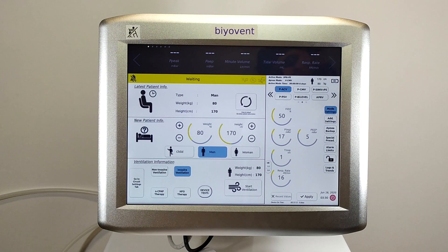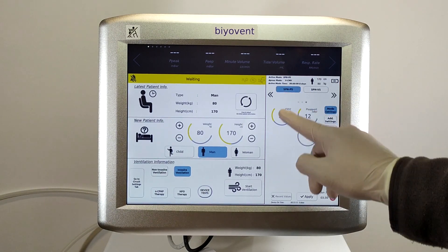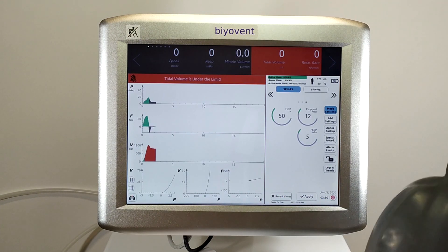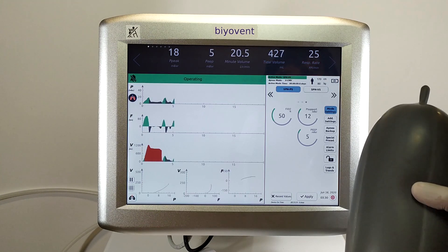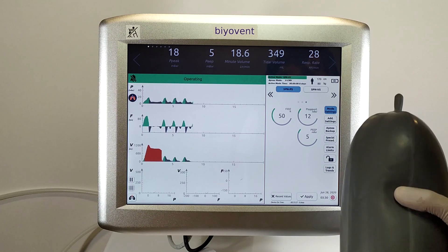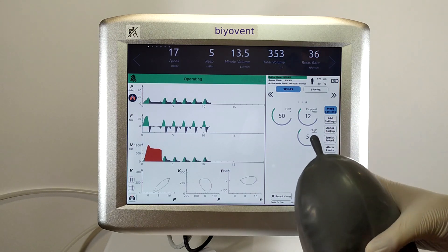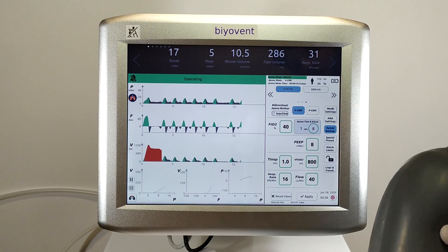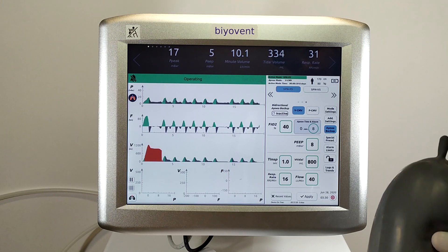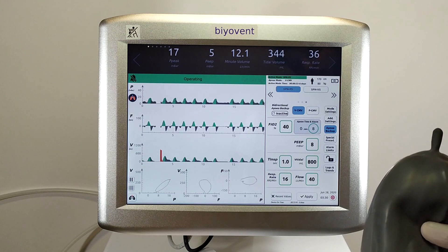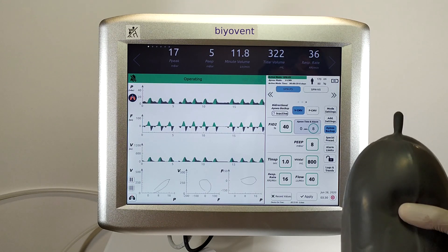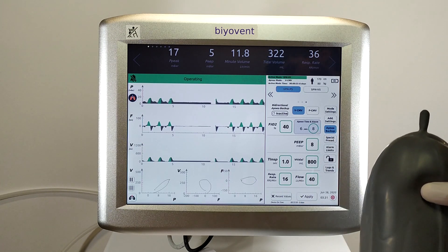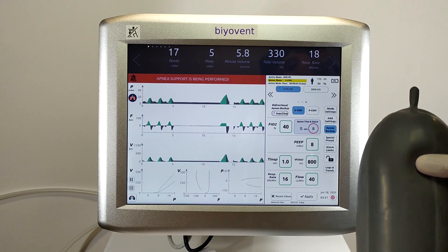Now let's simulate with inactive bidirectional mode. I'll select a spontaneous mode, then press apply and start ventilation. I will trigger as before. As you can see, bidirectional apnea backup mode is inactive. After the preset time, when I stop triggering, it goes into apnea mode. As observed, apnea mode has started.